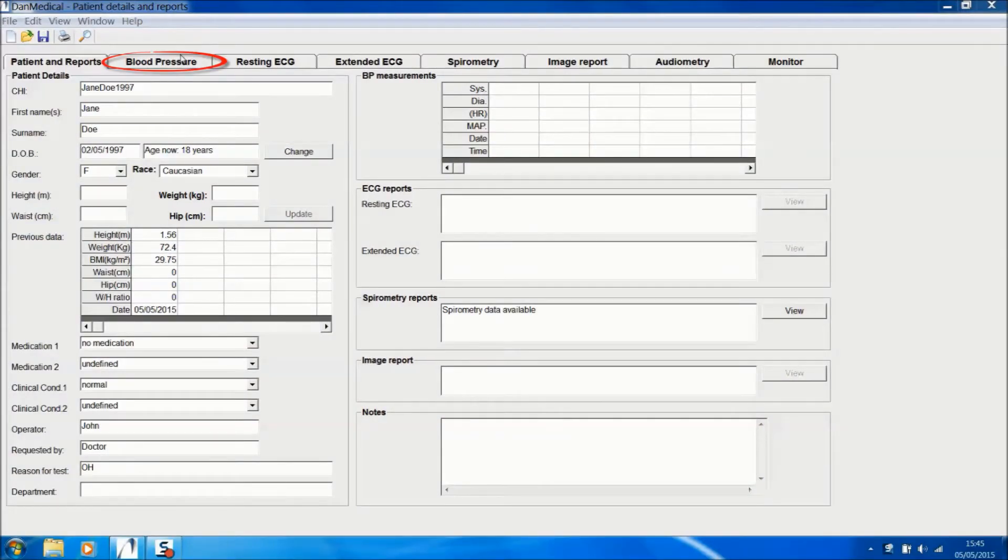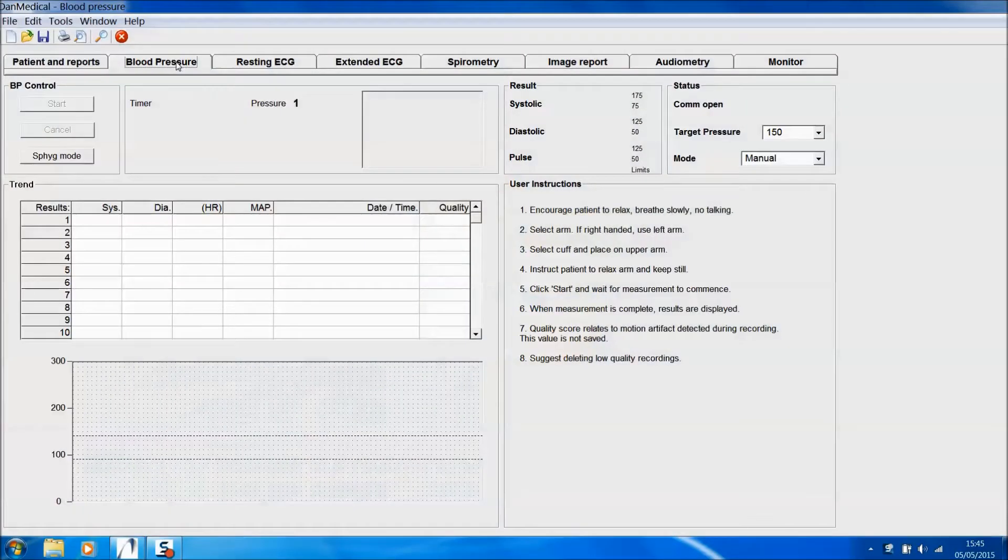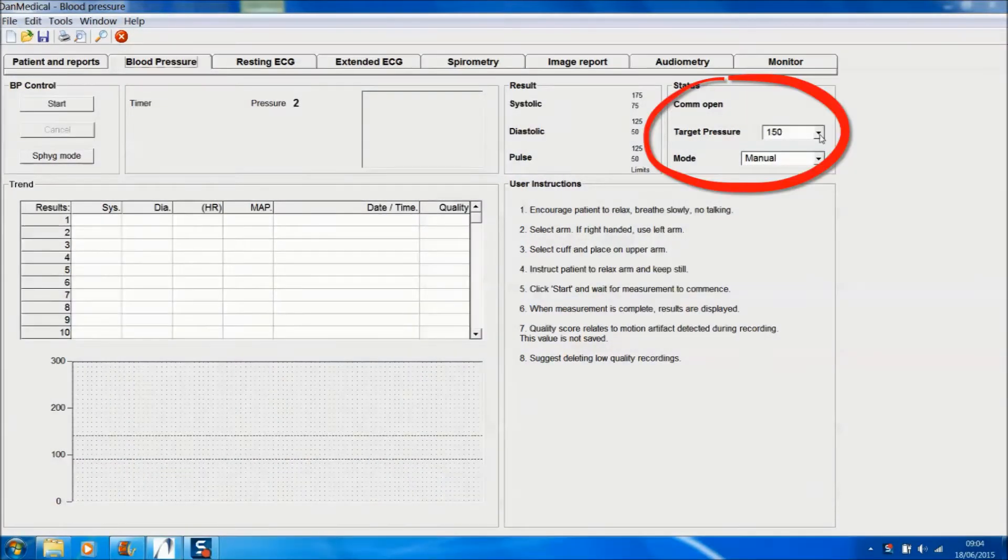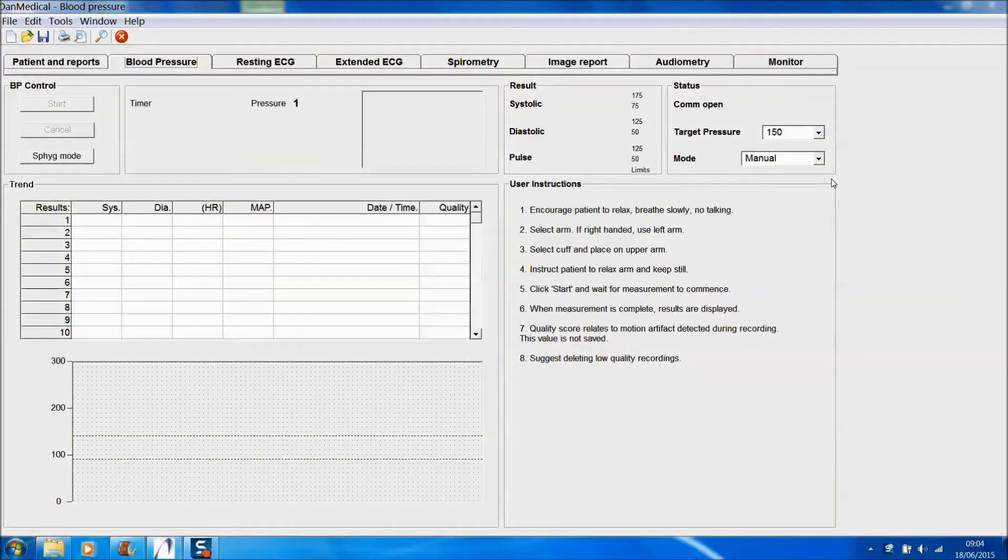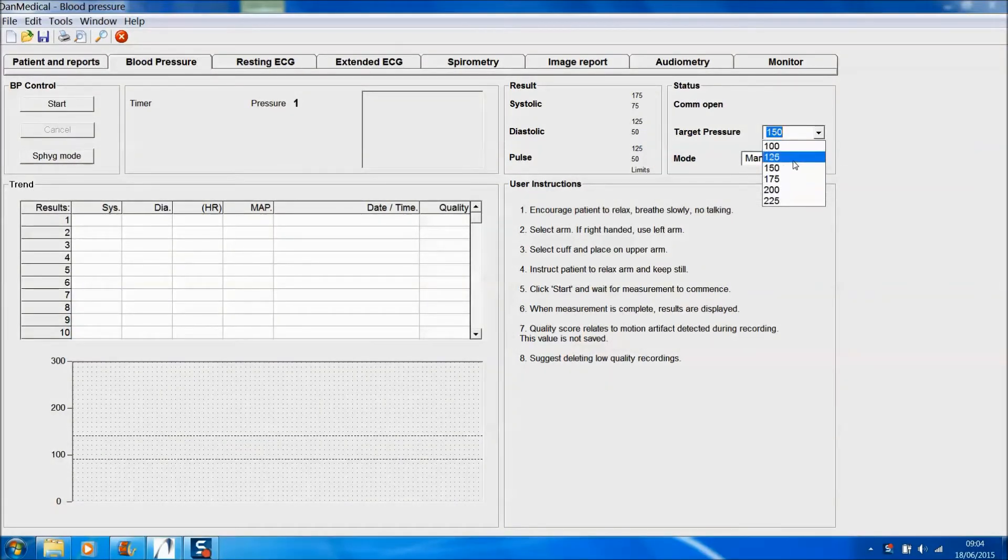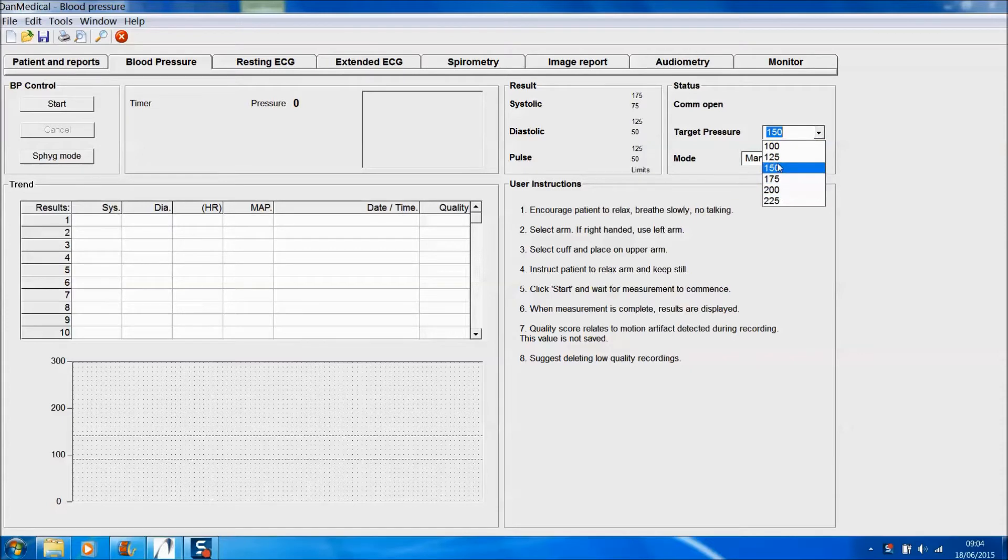Click the blood pressure tab to move to the blood pressure module. The software is set for a normal target pressure of 150, but you can reduce or increase the target pressure using the drop-down menu.